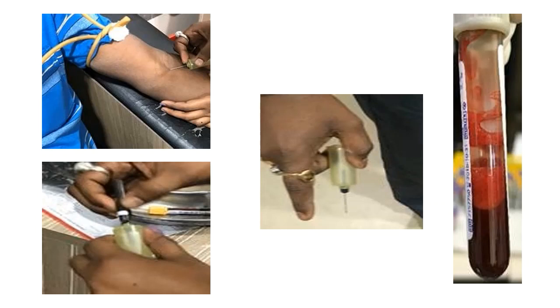Also, another wrong practice by the phlebotomist is recapping of the needle, which may lead to a needle-prick injury to the finger. So that is also not allowed. This is excessive or vigorous shaking of the tube, which may lead to hemolysis. So these are some wrong practices. So what are the improvement steps?